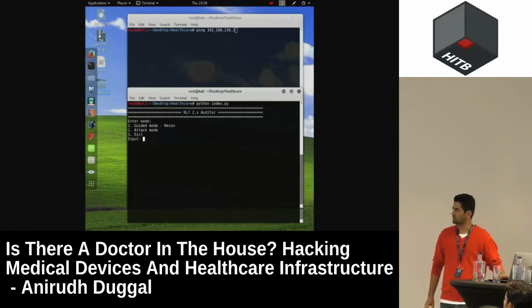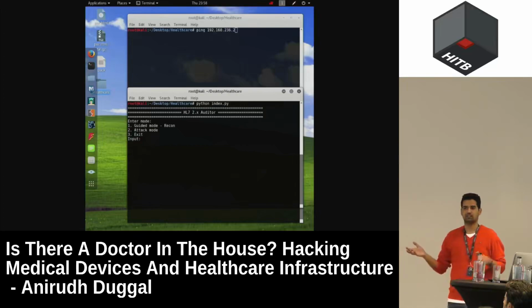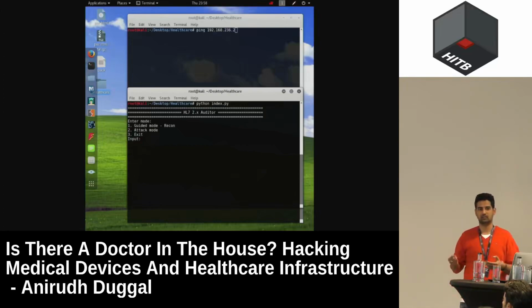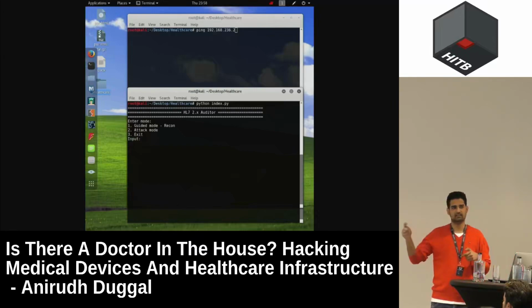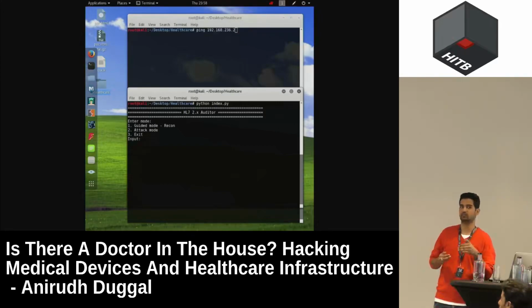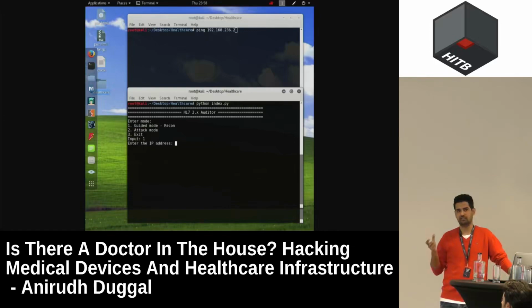This is a tool that I wrote. This one is guided mode. You just tell it to scan an IP, and it'll scan for the ports. The way it works is it starts sending deformed packets, and sometimes it sends really good packets and waits for acknowledgement from the server. It'll send a message and then look at the packet and the kind of response that was sent. And if it finds it to be useful, it would actually say that you found a port.